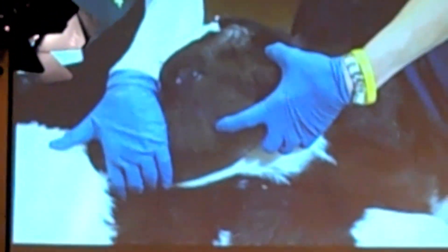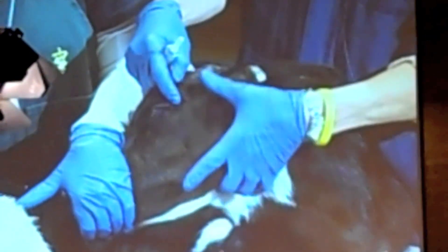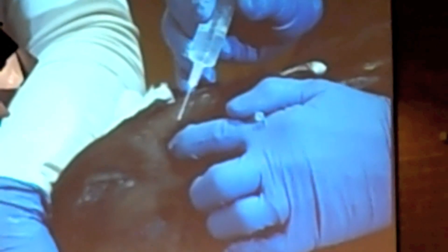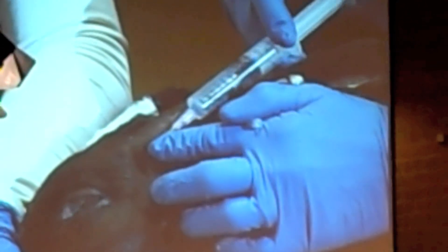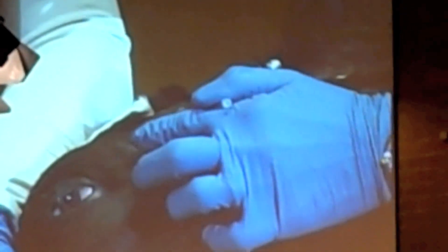In a young calf, the biggest nerve — and often the only block veterinarians will train you to do — is the cornual nerve, the one that goes to the horn. The major branch is halfway between the outside of the eye and the horn. Make a line from the outside of the eye to the horn; you'll feel a bony ridge there, and halfway in between you'll feel a spot where the nerve runs. I'm not injecting the nerve, but placing the numbing agent around it by slipping the needle underneath the skin and injecting two cc's right there.